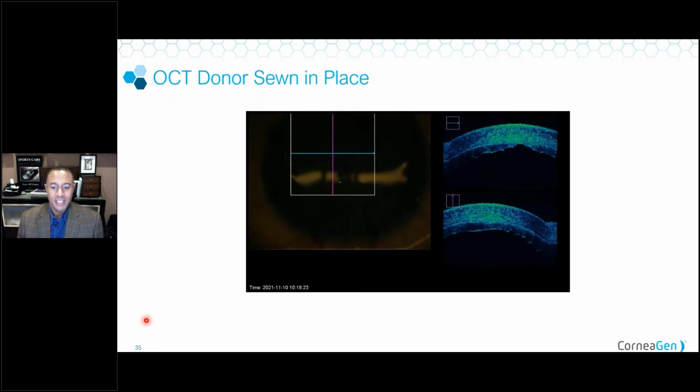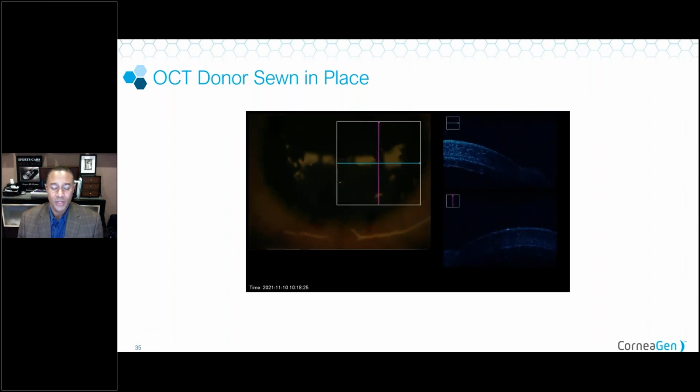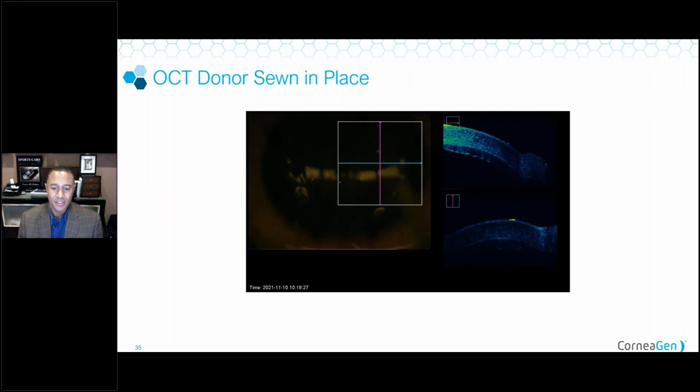Here's the OCT immediately after. You can see those wrinkles in the posterior stroma, and you can see the apposition of the donor cornea to the recipient bed. Next slide.